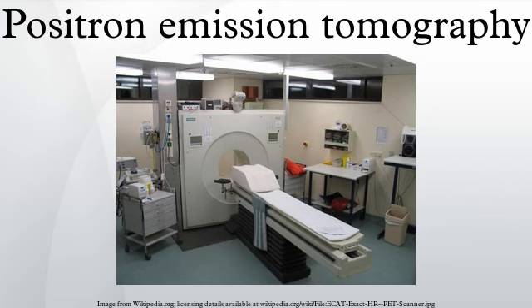Due to the short half-lives of most positron-emitting radioisotopes, the radiotracers have traditionally been produced using a cyclotron in close proximity to the PET imaging facility. The half-life of fluorine-18 is long enough that radiotracers labeled with fluorine-18 can be manufactured commercially at off-site locations and shipped to imaging centers. Recently, rubidium-82 generators have become commercially available. These contain strontium-82, which decays by electron capture to produce positron-emitting rubidium-82.